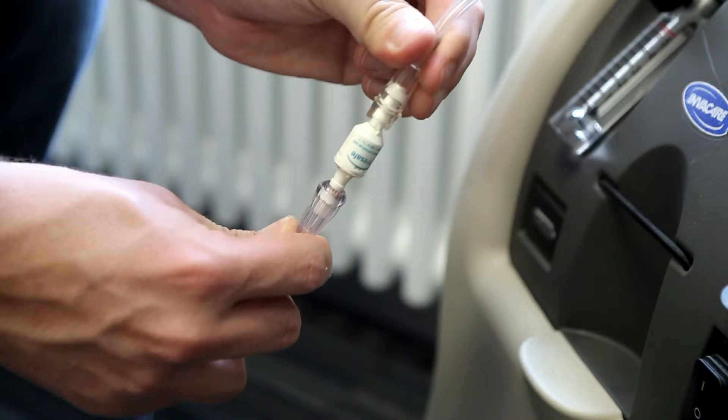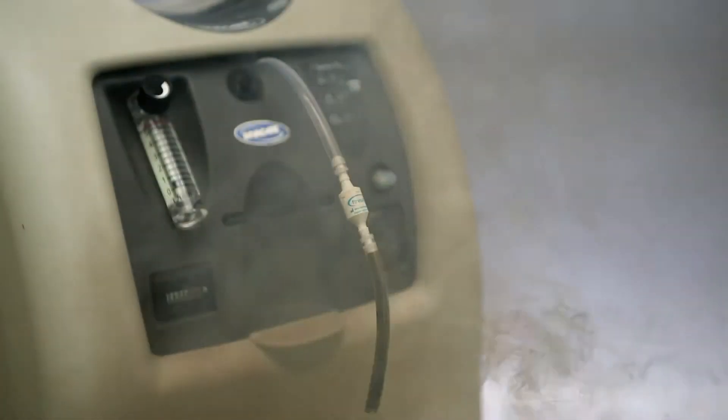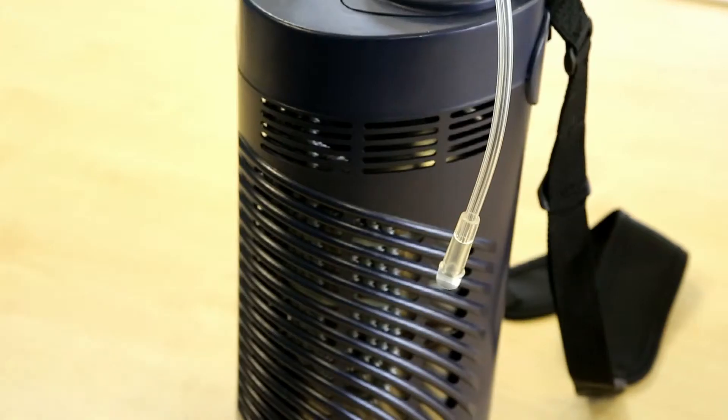Fire brakes extinguish oxygen tube fires and isolate the oxygen supply. This reduces the amount of toxic smoke generated, stops the fire tracking back to the supply and significantly reduces the risk of a large structural fire developing.